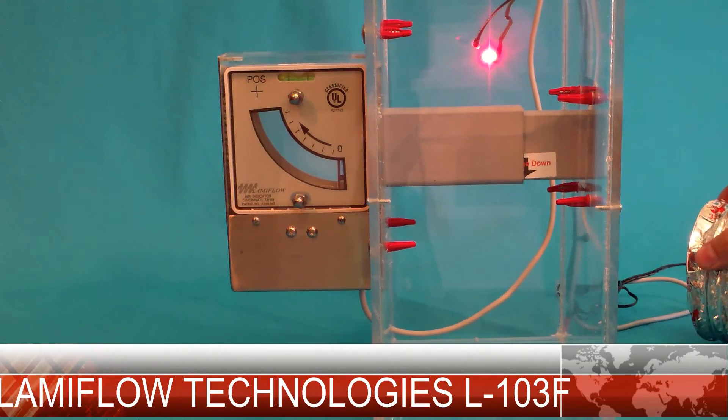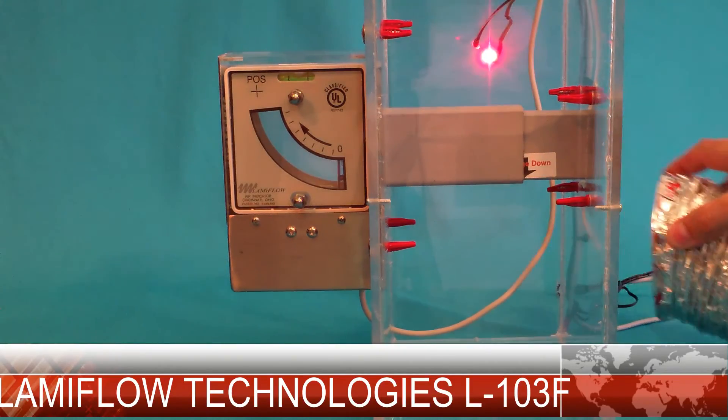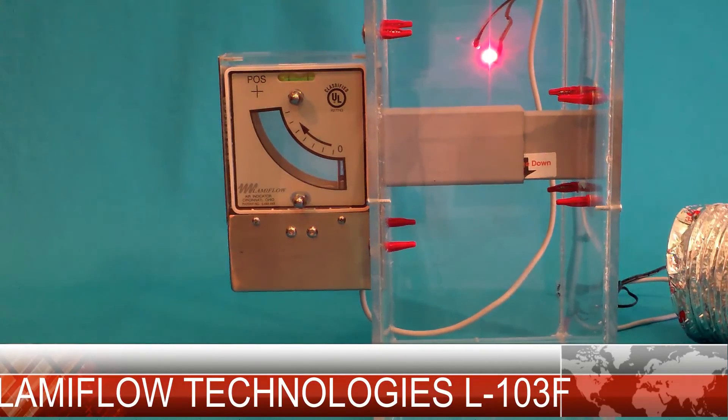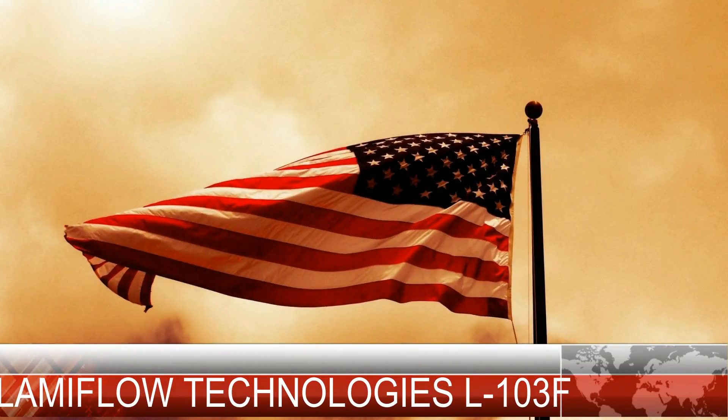Our graduated meter design allows readings well above and below negative 0.10 inches water column, so you can be confident that even the toughest rooms of your facility can be monitored with a Lamiflo indicator. Lamiflo indicators are installed in over 1,800 healthcare facilities, so the technology is well proven and accepted. Everything Lamiflo Technology produces is 100% designed and built in the USA.